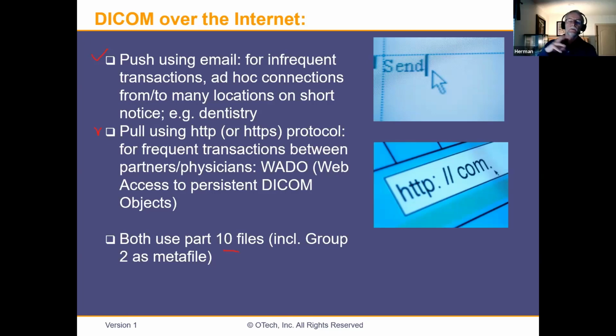connection, how does it work? We set up a connection, let's say from the CT scanner to the PACS system. The CT scanner says to the PACS, hello, I have some CT images and also some structured reports that contain some dose information. Do you understand that? So we negotiate an association.